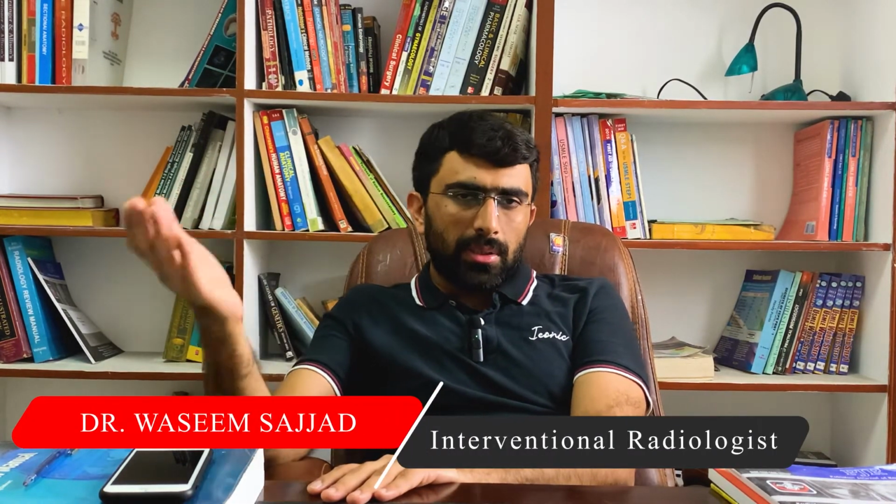The signal on the T1 weighted images is either isointense or hypointense, and the signal on the T2 images is also hypointense because oxygenated hemoglobin is no longer present. It is deoxygenated hemoglobin and it appears hypointense on T2 weighted images.